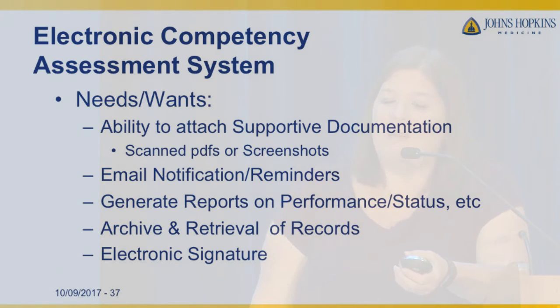Also, archival and retrieval of records, so we could keep our records, and that way we can get rid of them after the 5 years, or they can literally stay there indefinitely. But it would make for ease of access. You're not hunting through things to produce those documents when the assessors arrive.